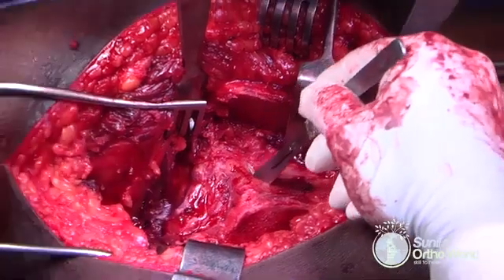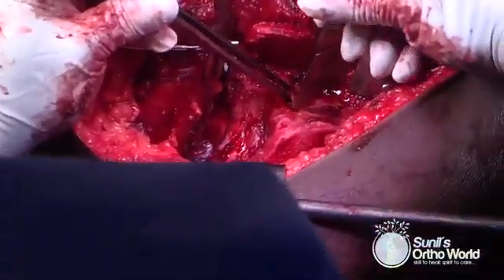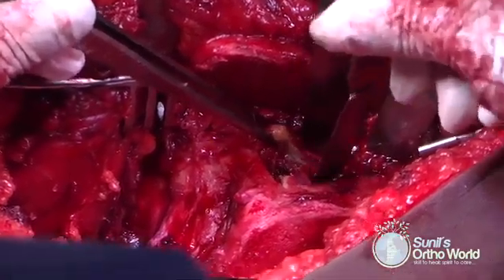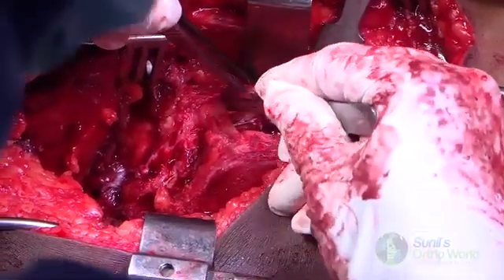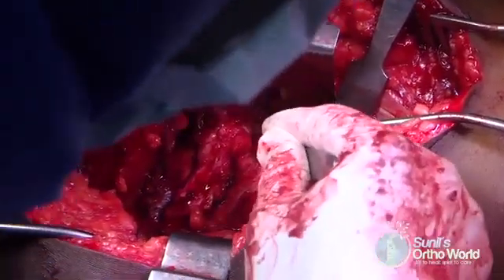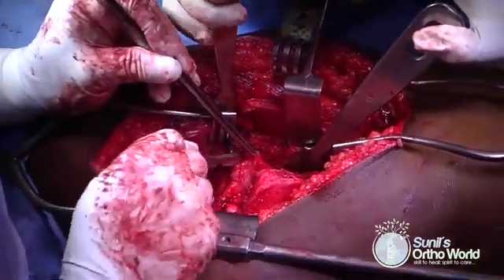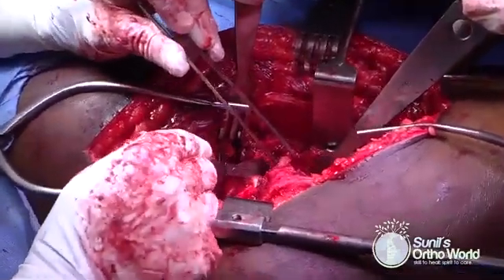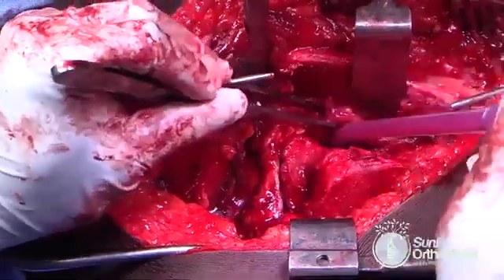The anterior limb of the capsulotomy is performed first. It is then taken down into the inferior capsule, which is completely released. When the capsulotomy is extended into the medial aspect, you have to be extremely careful not to violate the labrum. Finally, the superior aspect of the capsulotomy is done. The capsulotomy is now completed and you can see two capsular flaps: a superior and an inferior one.